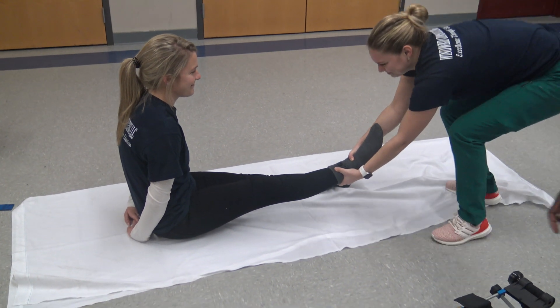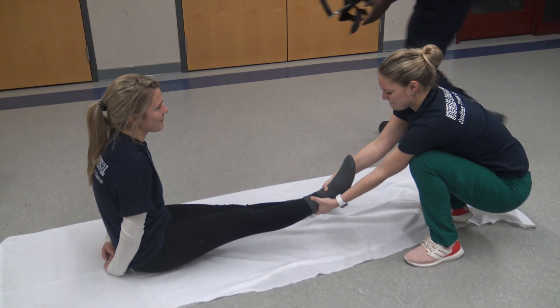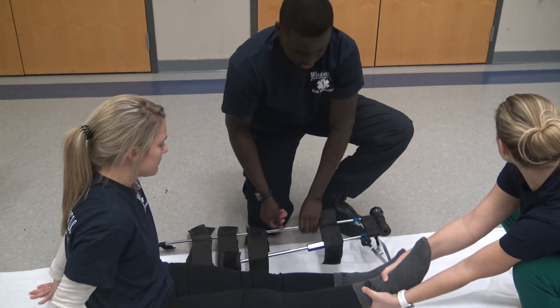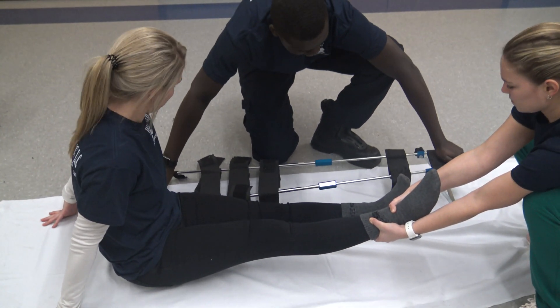At this point in time I'm going to get ready to properly apply traction. I'm going to measure the traction splint on the uninjured leg. I want to go about six inches — that's the ankle.